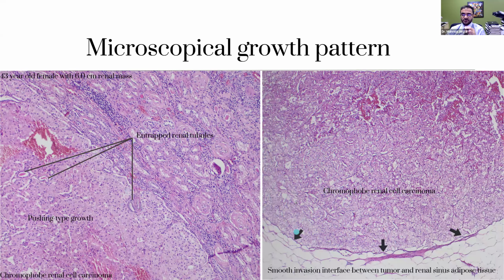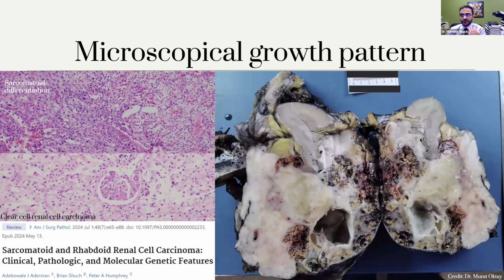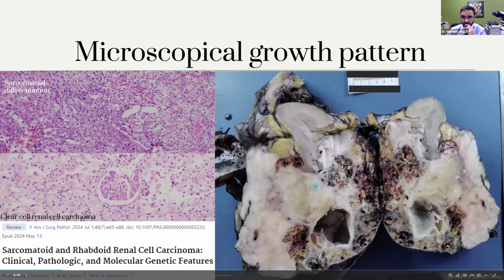And even if you have renal sinus infiltration, in this case, this interface is almost always the same, smooth interface.